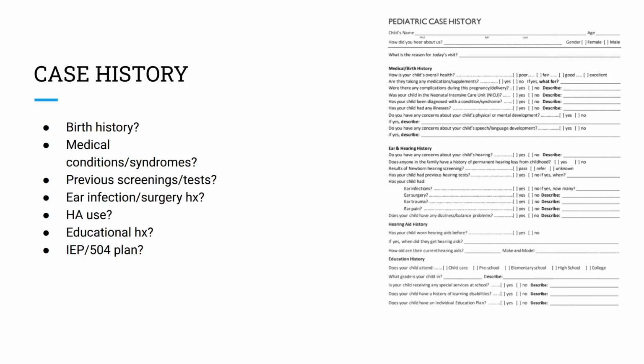Did they have a history of ear infections? Did they have tympanostomy tubes placed ever? Have they used hearing aids before? What is their educational history like? Did they have an IEP or a 504 plan? So those are all things that are of note to you when you're evaluating a pediatric patient.